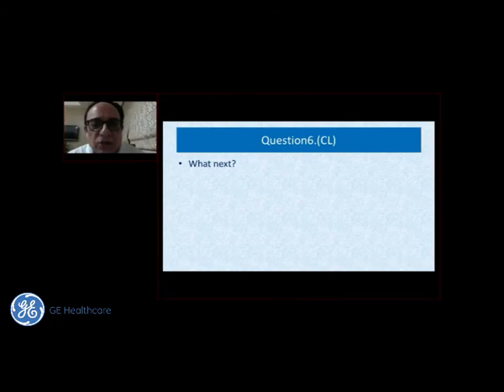Okay, so as you saw here, there is a drop in the growth from the 14th to the 3rd centile. But is the Doppler normal yet? The Dopplers are normal. Yes, the Doppler is normal. So yet I wouldn't be very worried because the fetus is yet on the 3rd centile, mother is small. Most importantly, the Doppler is normal.